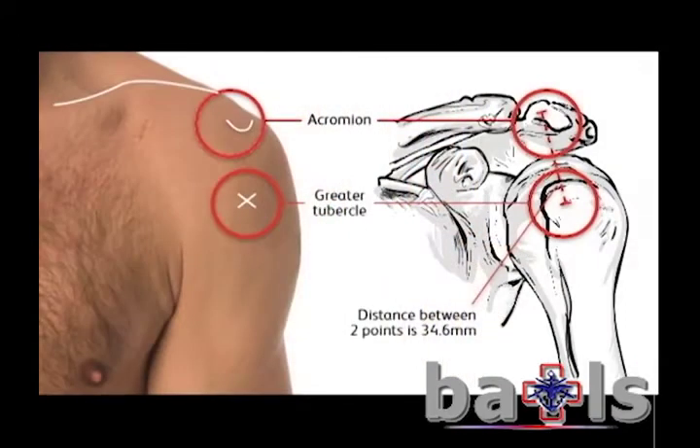To locate the site on the humerus, identify the acromion and the lateral aspect of the clavicle and measure approximately two fingers down.